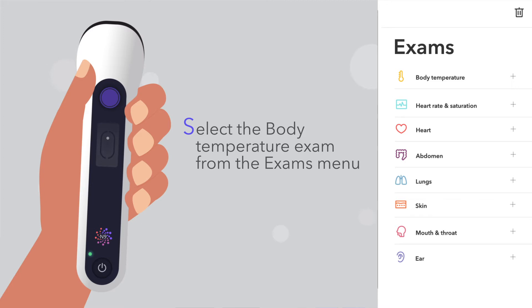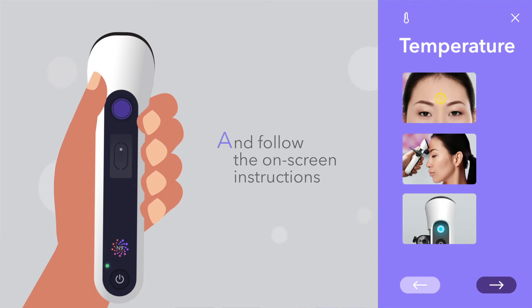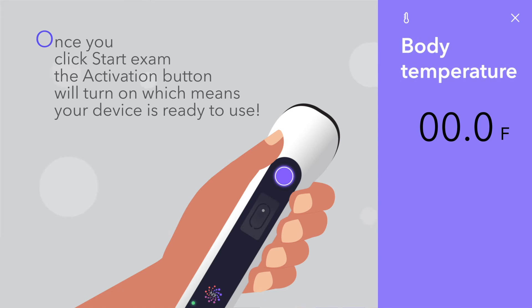Select the body temperature exam from the exams menu and follow the on-screen instructions. Once you click start exam, the activation button will turn on, which means your device is ready to use.